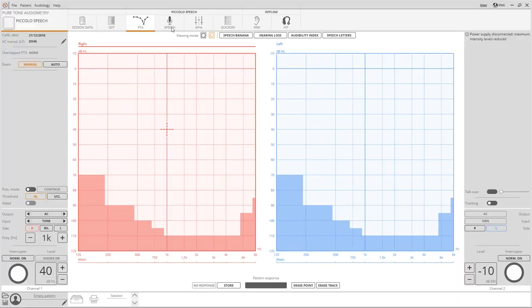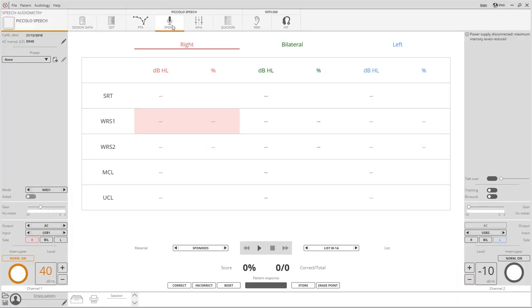Select speech from the list of exams available to start a speech audiometry test. A word list can be read through a microphone or it can be played directly from the computer while looking at the words on the display.